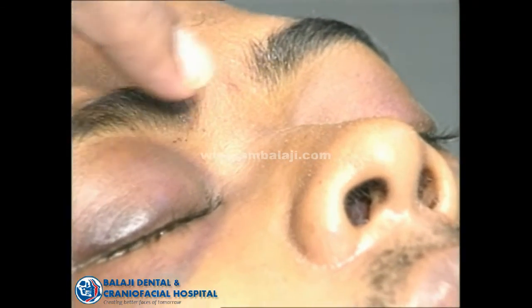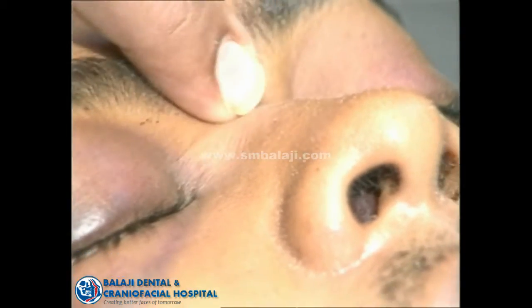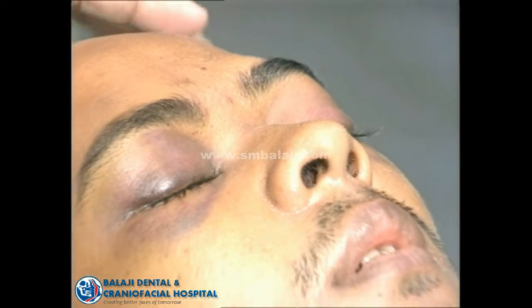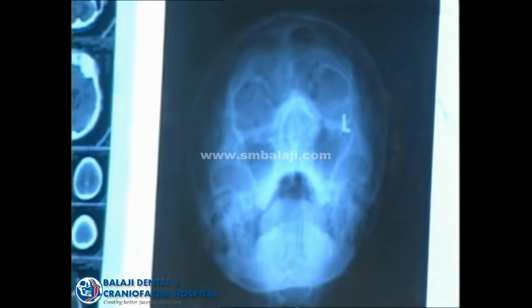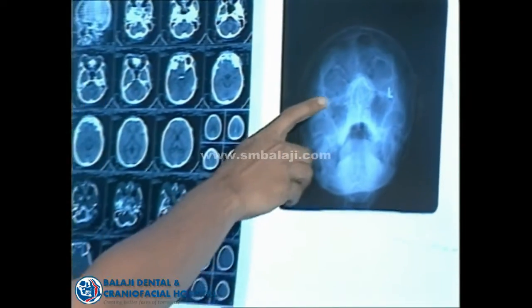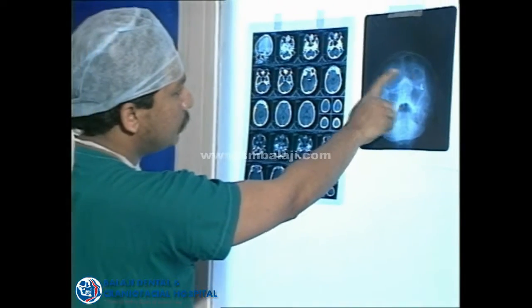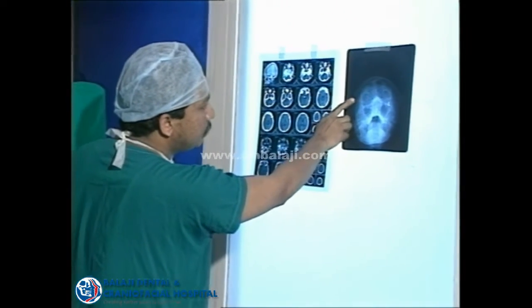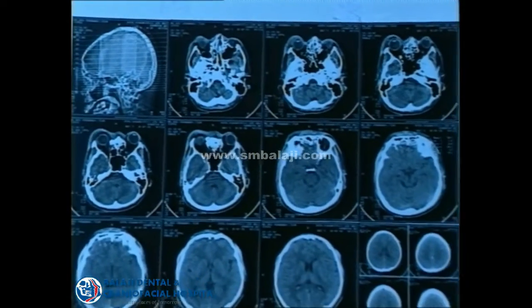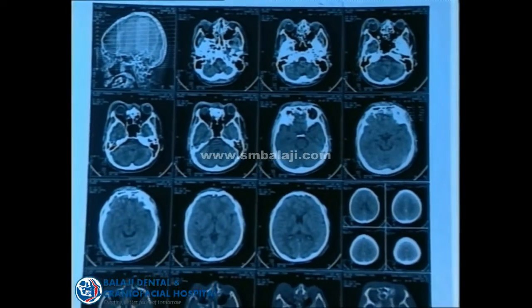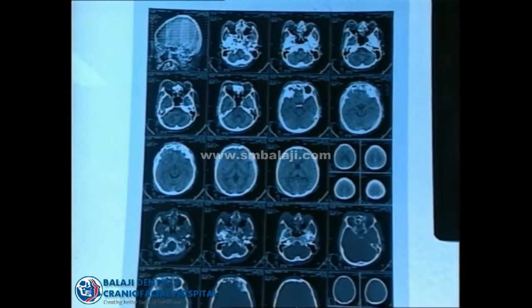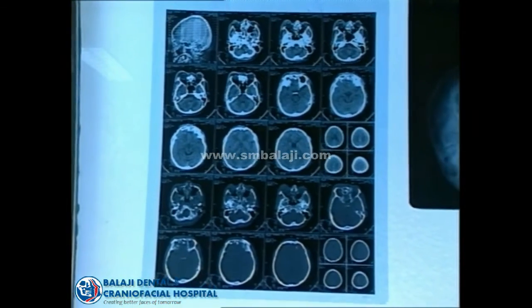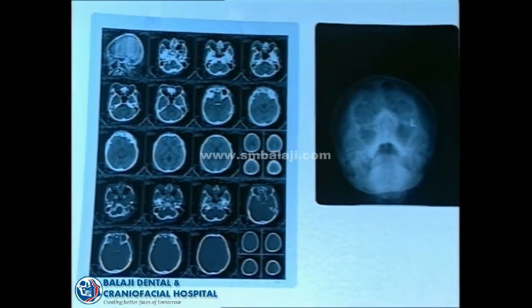This boy had a road traffic accident and there is a naso-ethmoid fracture with the frontal bone fracture. You can see there is a depression on the forehead and he had CSF rhinorrhea. The CT scan and X-ray show there is an outer table fracture with the inner table. Elevating the outer table is only for cosmetic purposes, but the inner table fracture causes the CSF leak because there may be a dural tear.